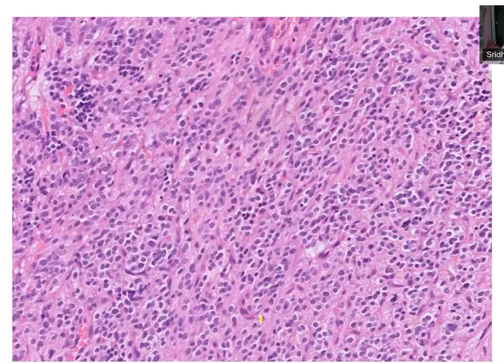Yeah, then is there anything in this portion of the slide? I'm marking it. Is there anything you want to highlight in this? Anybody else in the team? Is this clear cell change? The cells are showing clear cell changes. Yeah. So what is highlighted is there are cells with a perinuclear halo around them.